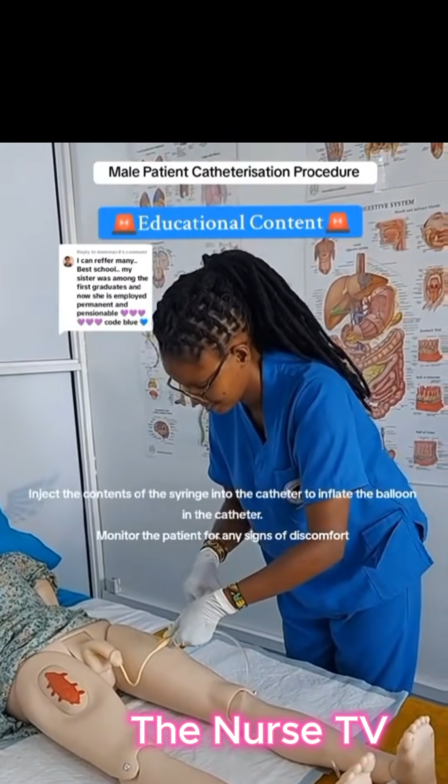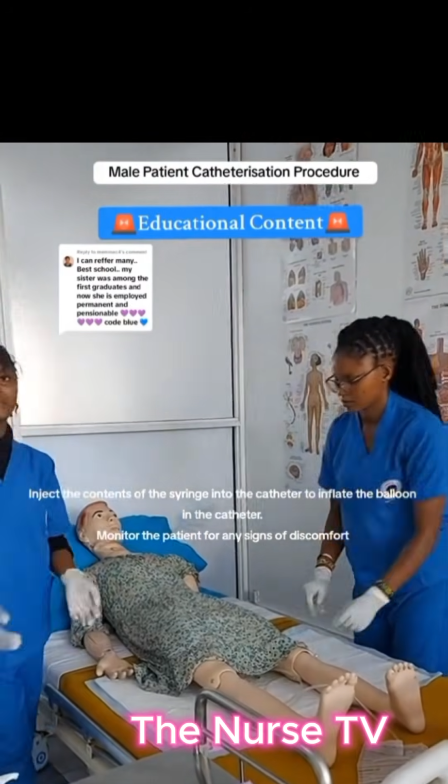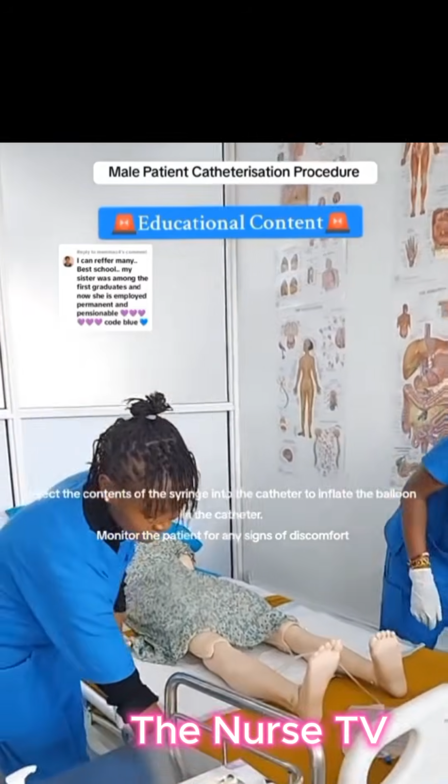Inject the contents of the syringe into the catheter to inflate the balloon in the catheter. Monitor the patient for any signs of discomfort.